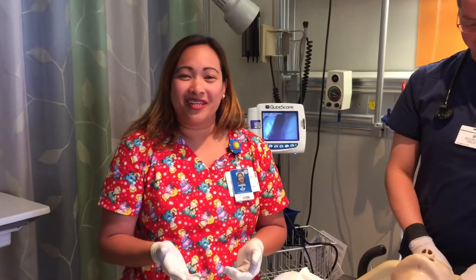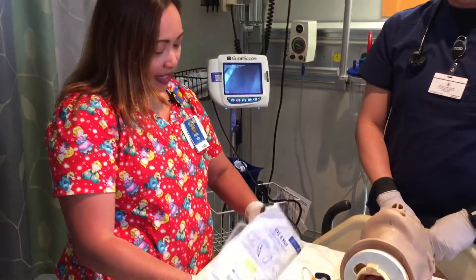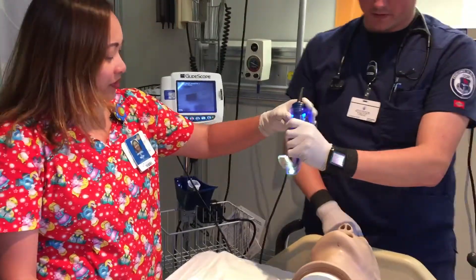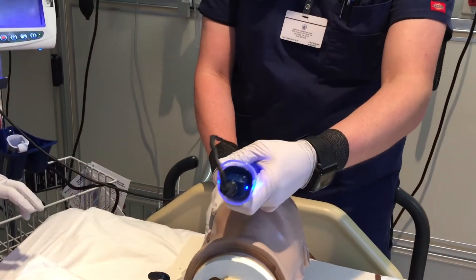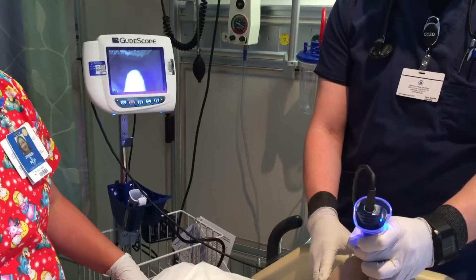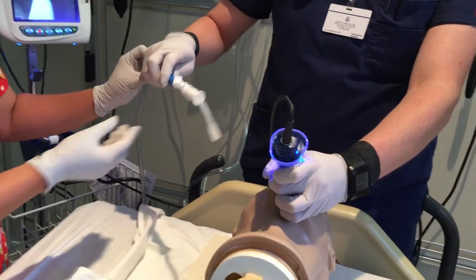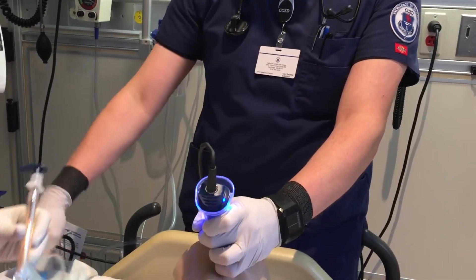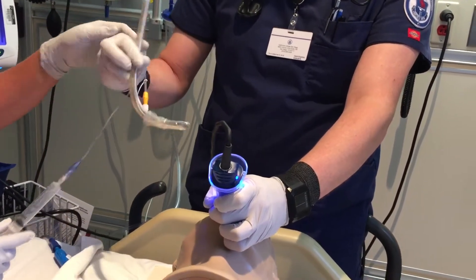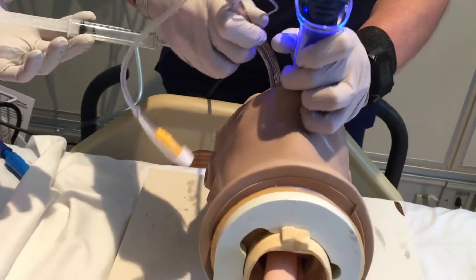Now we will proceed to the actual intubation. We have to make sure that all the equipment is close to the patient and all within reach so it's ready for use. Step one: doctor preps for GlideScope — hand it over to the doctor. When he's inserting the GlideScope, we can visualize it on the screen. We can hand them the suction if needed too. Then be ready for your tube and hand it over to him. Now he will start inserting the tube into the patient.